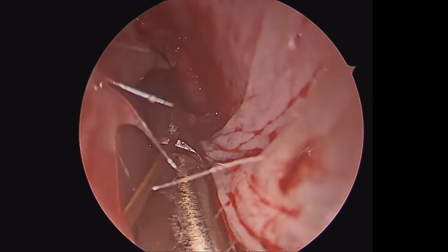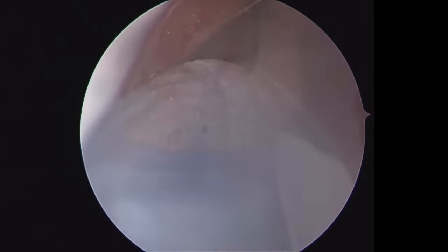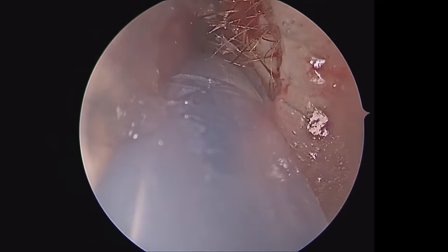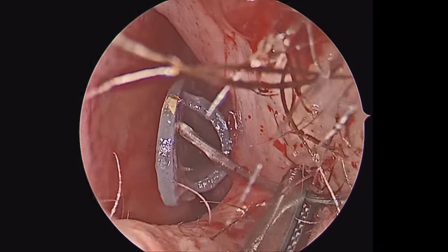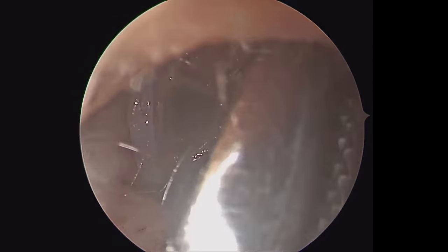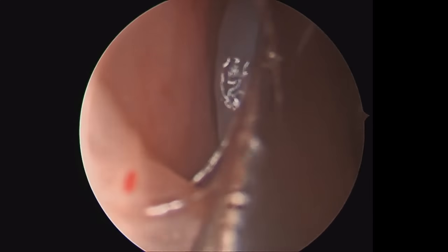Next, we're going to slide in Doyle splints. I don't always use them, but sometimes they are helpful to keep the septum straight and the mucosal flaps approximated. We use a nylon suture through the septum to hold the Doyle splints in place. You want to be sure the front of the Doyle splint is not pushing against the piriform or the lateral cartilages, and we usually keep those in place for a week.